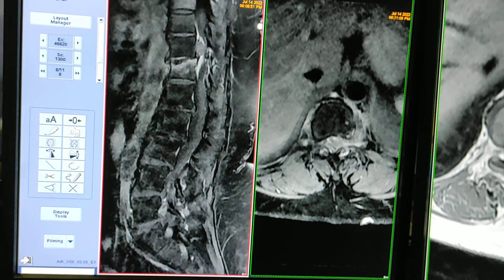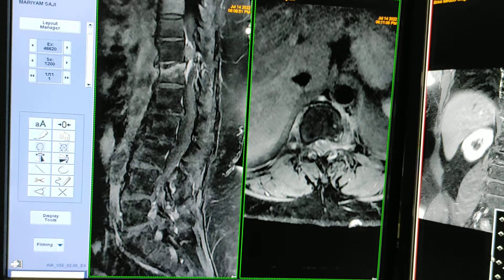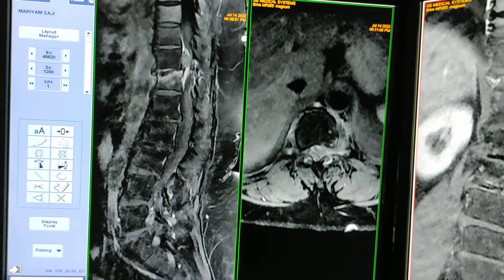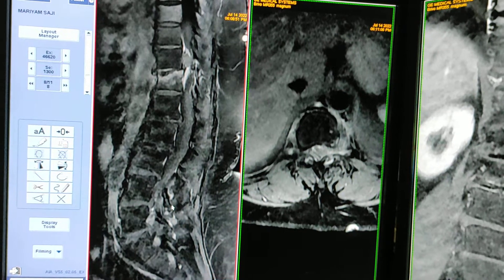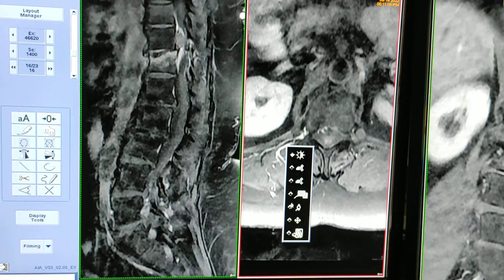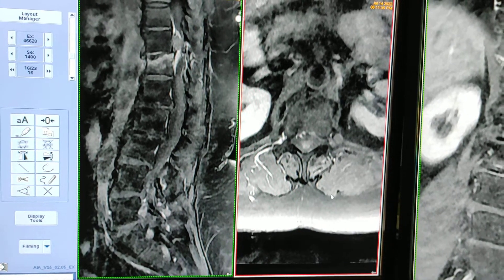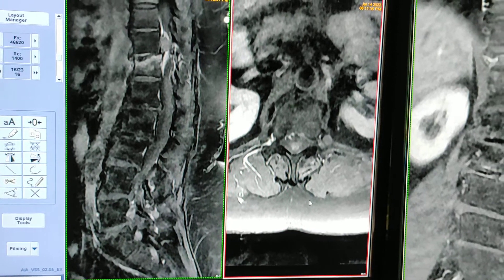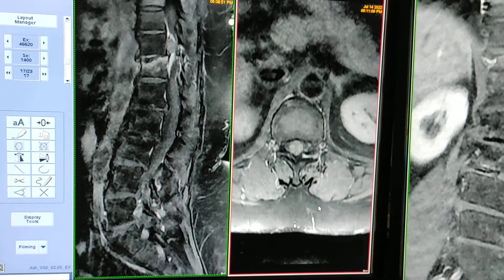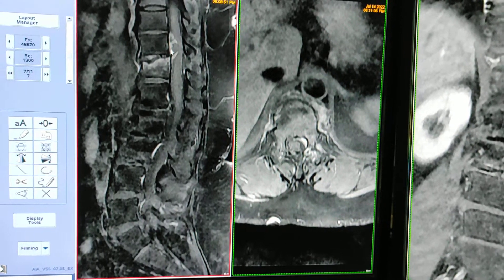Now we have three post-contrast images showing the enhancement region. Sometimes if a patient does not agree to contrast, you can still give differential possibilities in the report. You should write: 'Contrast studies needed' or 'Contrast studies suggested.' This is the whole enhancing lesion.